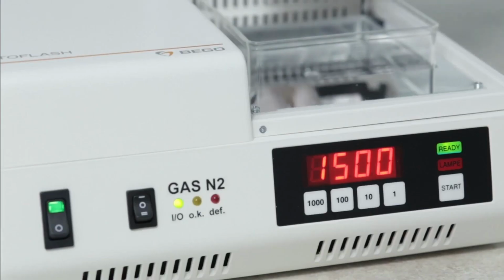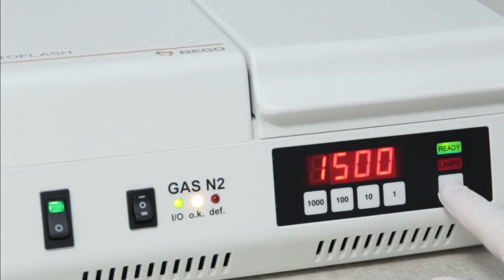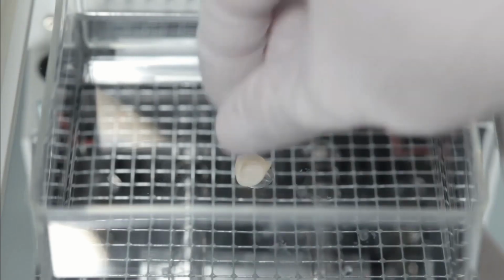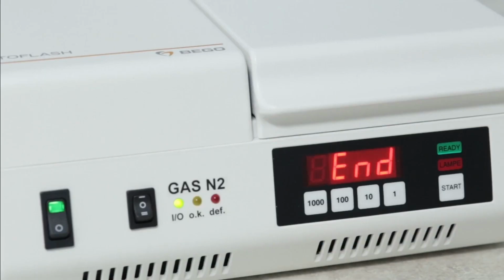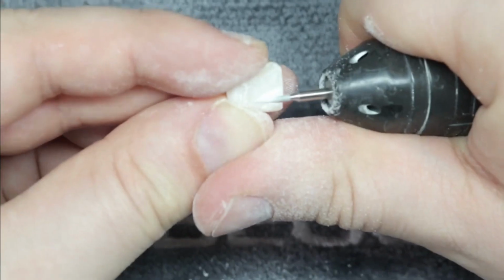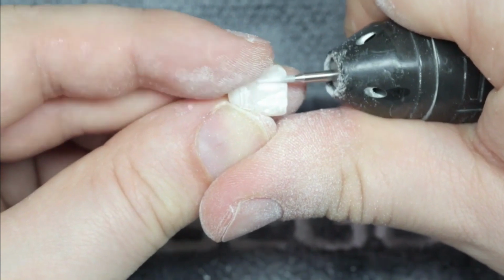Here it's being sandblasted before curing. That removes that chalkiness. And it's going to be cured in 2 cycles. 1500 flashes, which is approximately 3 minutes, and then flipped over, followed by another 1500 flashes. Here you see that they're going to carve some anatomy in there using the diamond burr.